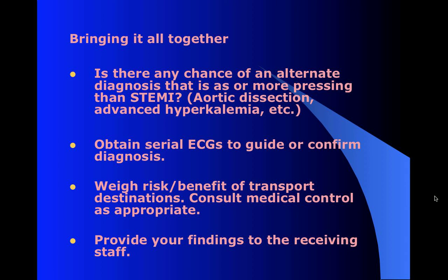If you need to, talk to med control, and make sure when you get wherever you're going, you show them what you found, because they may not be looking at the same things. They may be on a very different track. They may not be thinking about things like Brugada, so make sure you give that to them. Turn over your early strips if you can.